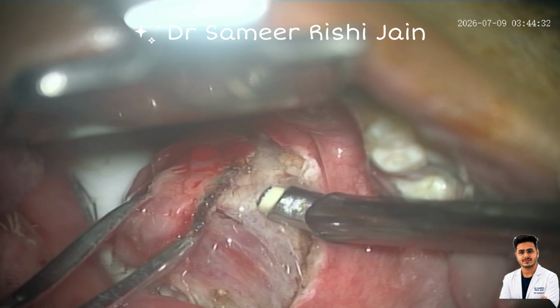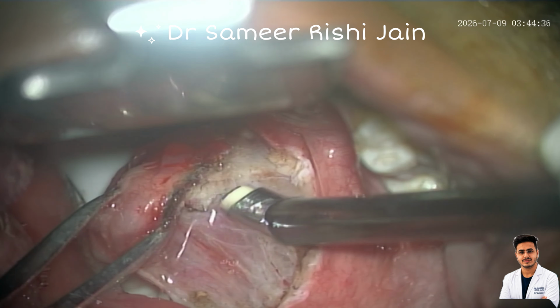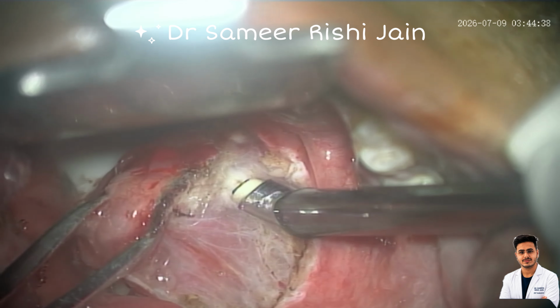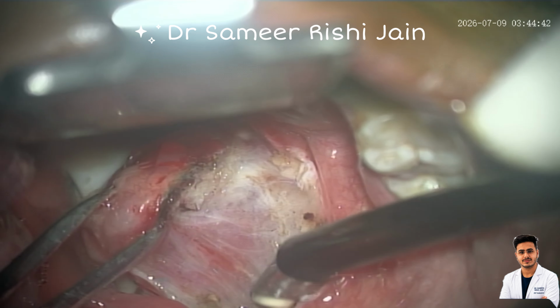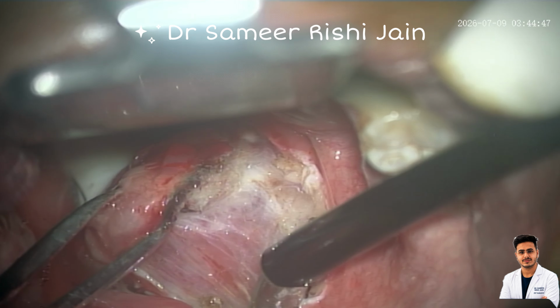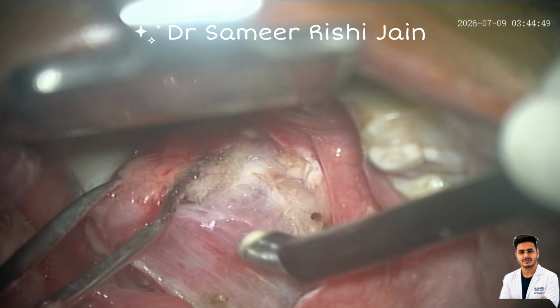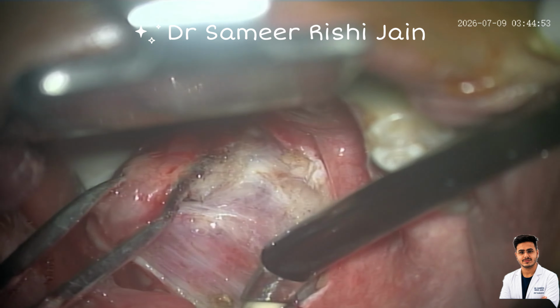As we progress our dissection, we have to hold the tonsil or pull the tonsil medially, and we have to change our grip according to the place we are dissecting. We can also push the tonsillar bed or the tissue laterally so that it helps us in dissecting in the correct plane.